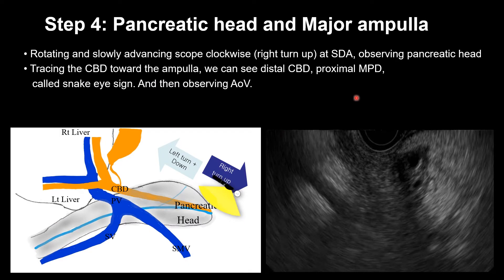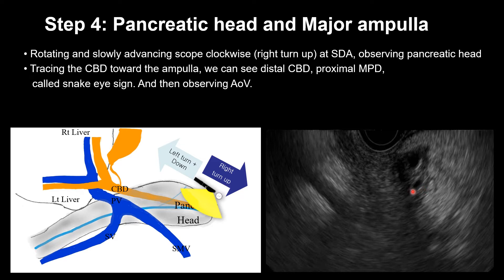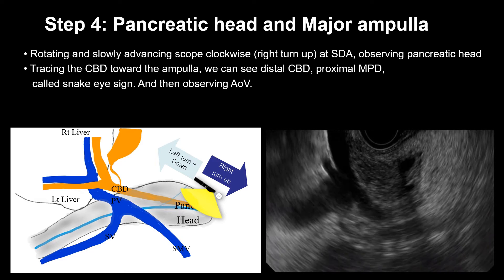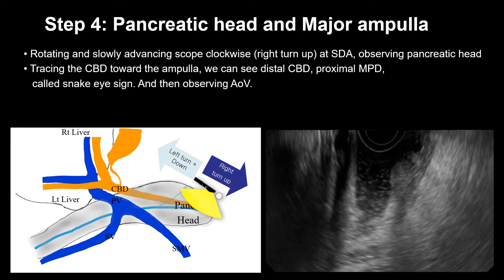For the pancreatic head and major ampulla, rotate the scope slowly with clockwise rotation at the superior duodenal angle, observing the pancreatic head area. Tracing the CBD towards the ampulla, we can see the CBD and proximal main pancreatic duct — we call it the 'snake eye' sign. This area shows the distal CBD and main pancreatic duct, similar to the snake eye. Then, pushing the scope, we can see the ampulla of Vater. Clockwise rotation reveals the ampulla of Vater.